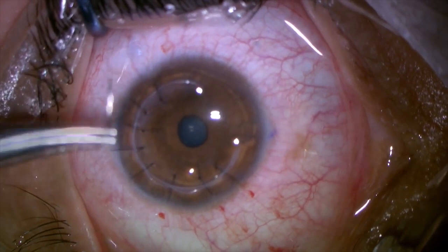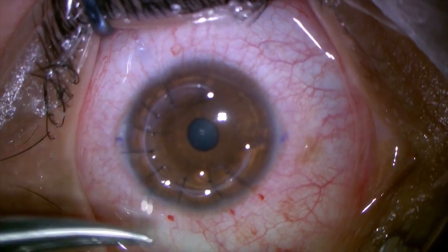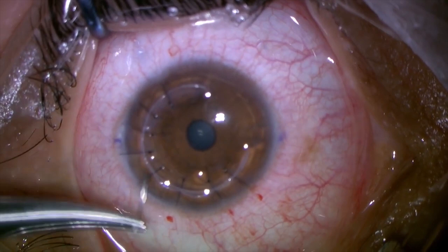Okay, we are here with Dr. Otero in the first case. So as you can see, we've distributed the sutures evenly. Basically, we did three initial stitches, this one, and this one, and then we started distributing the other sutures evenly. We had to reduce the intraocular pressure a little bit to get an even closing of the edges.